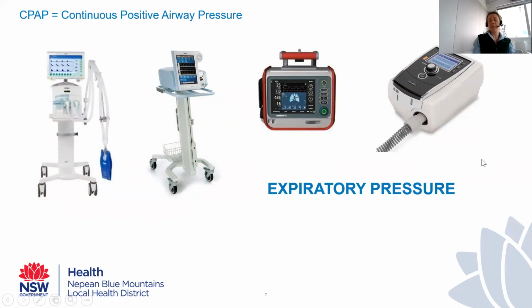But really, when it comes to giving the therapy of CPAP, they all do exactly the same thing. Obviously, the simpler designed ones are easier to use. I'm not going to say more intuitive, but there's less things to push, there's less things to look at. So it's easier as someone who's a novice or someone who might not be familiar with that particular machine. It's often easier just to look at and work out how you set it. With the more complex machines, you'll often need an orientation or some specific training on those machines. That's not to say that you don't need them on all machines, but the more basic ones are often a bit easier to work out.